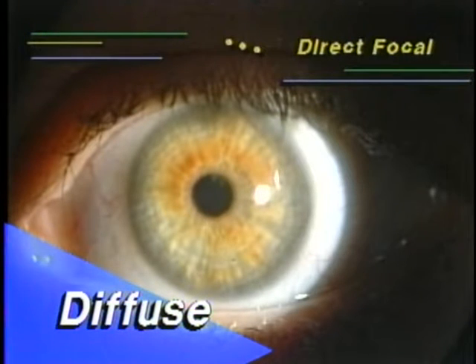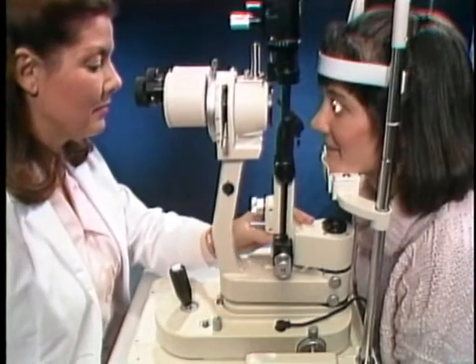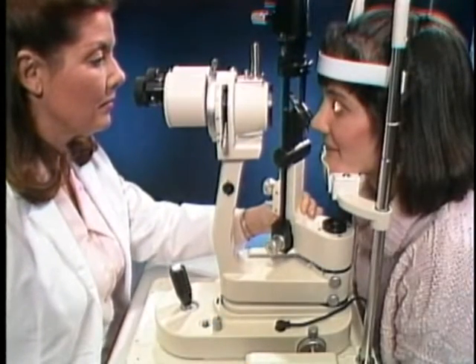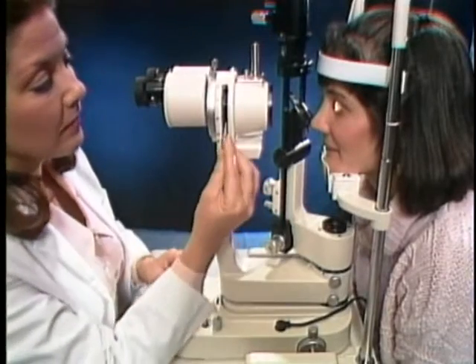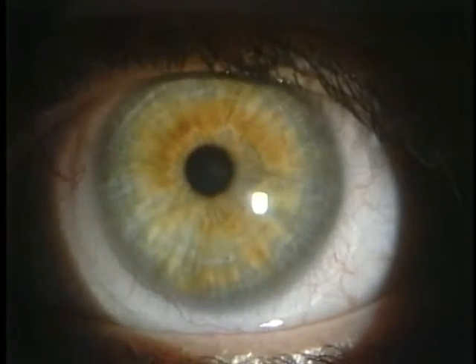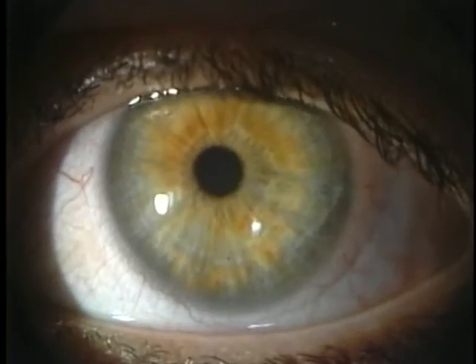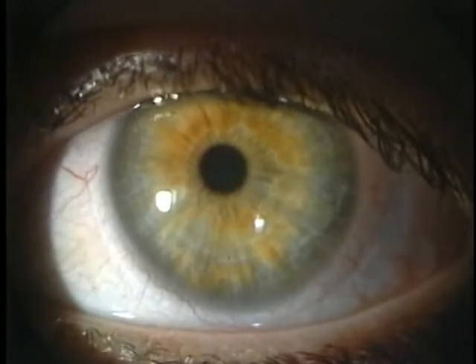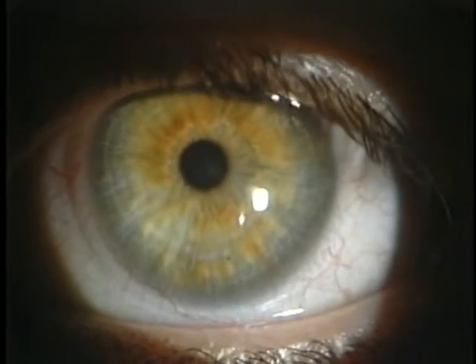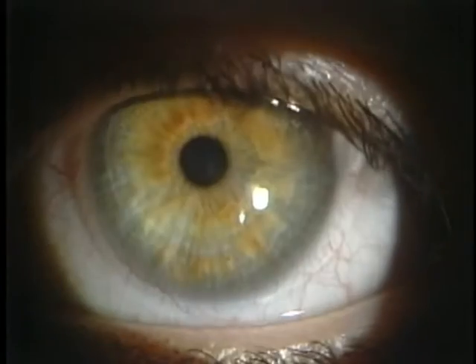A diffuse illumination is formed by using a wide slit beam. The light source and microscope are separated by 45 to 60 degrees, with magnification beginning on low. Diffuse illumination provides an overall view of the anterior segment and is especially helpful for contact lens evaluation. In our example, the entire field of view is illuminated to better observe the fitting dynamics of a soft lens, allowing for the evaluation of lens positioning, movement, and coverage.